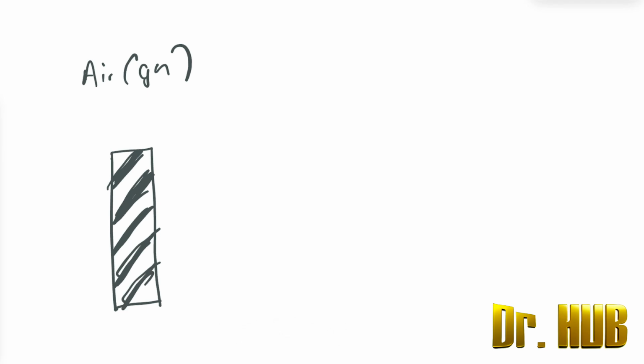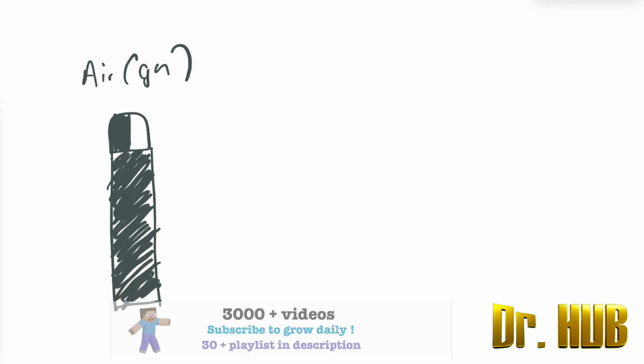And looking at the shoulder, it is either white or black. So the shoulder is either white or black, whereas the body is grey or black. So this is about the cylinder of gas or air.